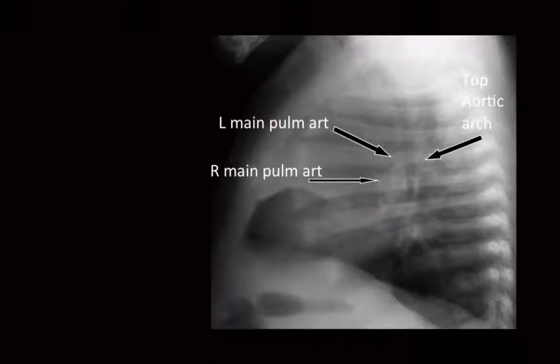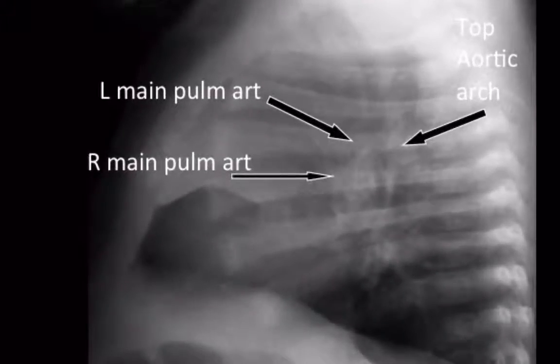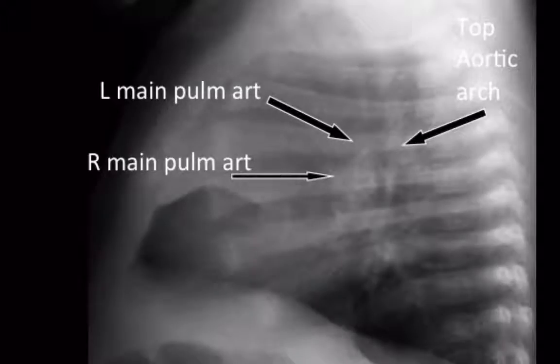Here's a bit of an anatomy lesson to help you out. The structures you see here are the right main pulmonary artery, the left main pulmonary artery, and the aortic arch. I'm not really asking you to be able to identify them individually. What I want you to understand is that they make a horseshoe — an upside-down horseshoe — below which are a bunch of diverging vessels.